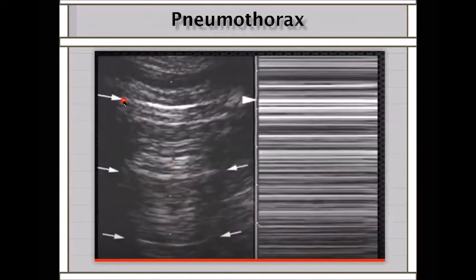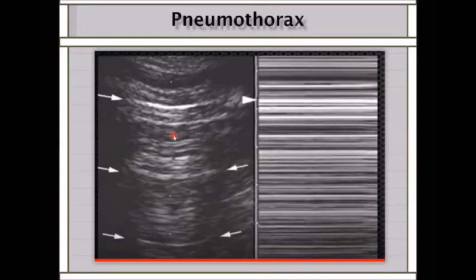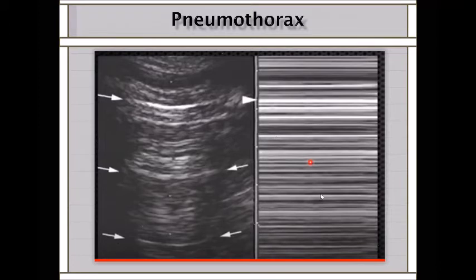The barcode sign on M-mode represents pneumothorax. Barcode represents A-lines—repetition of the pleura. When A-lines are present, it means air, and that air is either normal lung or pneumothorax. When you see A-lines and put M-mode, you will see barcode: sky, ocean, ocean, ocean—the repetition of the pleura—instead of sky, ocean, beach.